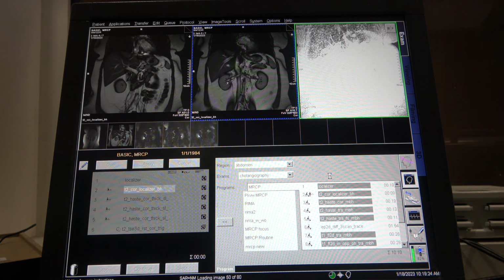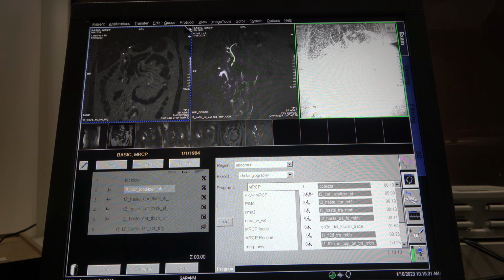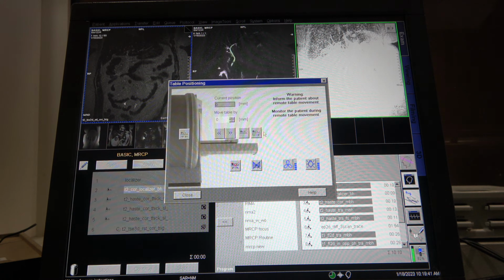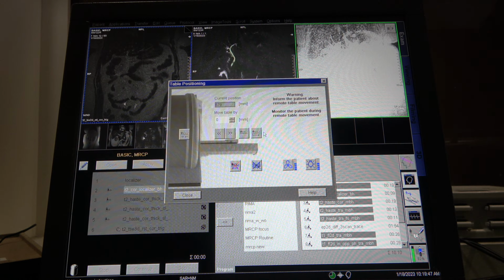Alright, that is it. Did we get everything? Boom, look at that. So nice, so nice, so nice. So there it is. Alright, let's get this patient out. And I'll show you how to MIP, okay? I'll pause this here.